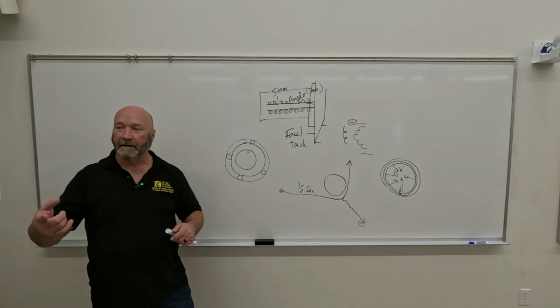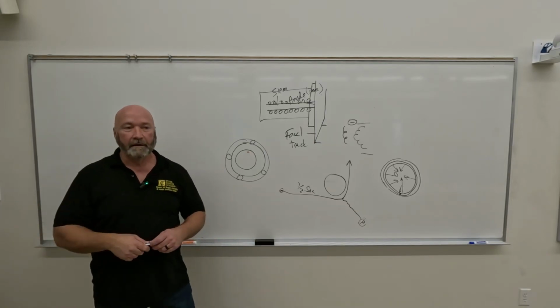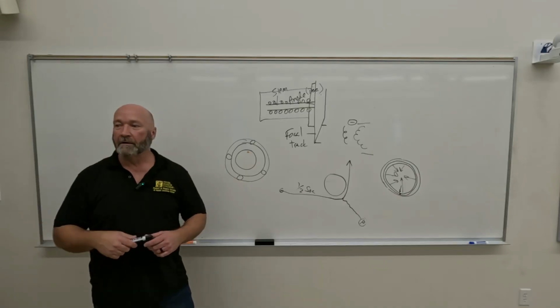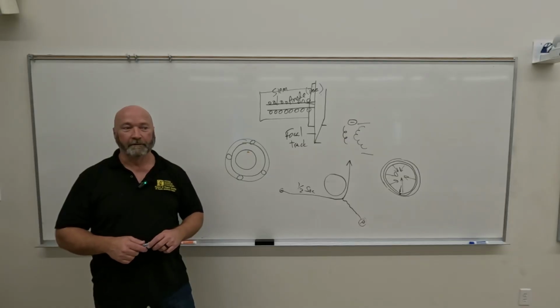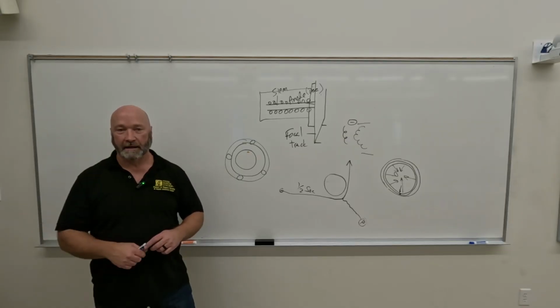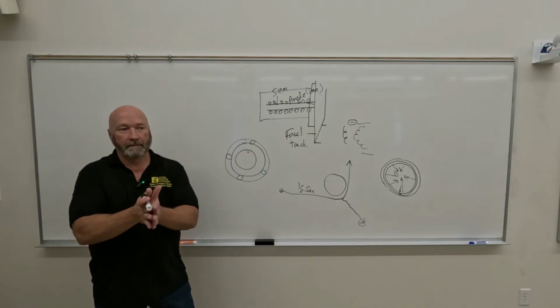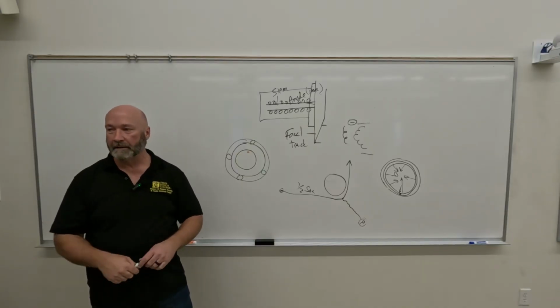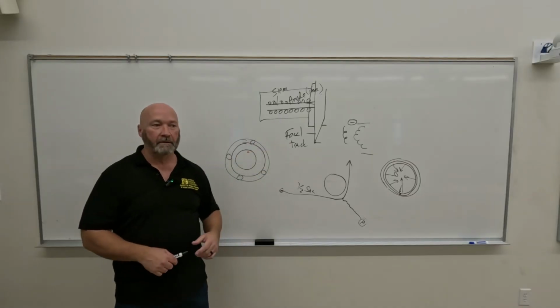Okay, so taking that the other way around, if you get it going 3,400 RPM and then you let it go, how long is it going to rotate? Forever. Yeah, it'll rotate a long time. So what's happening as you rotate? Friction is creating more heat. So do you want that to continue to rotate? And the answer is no.